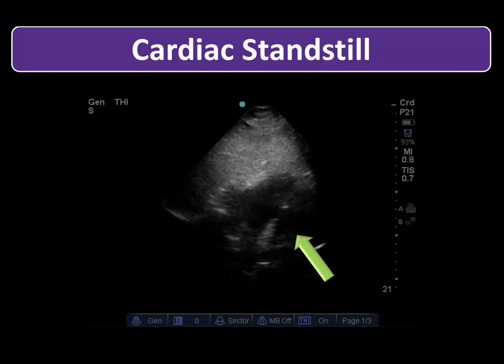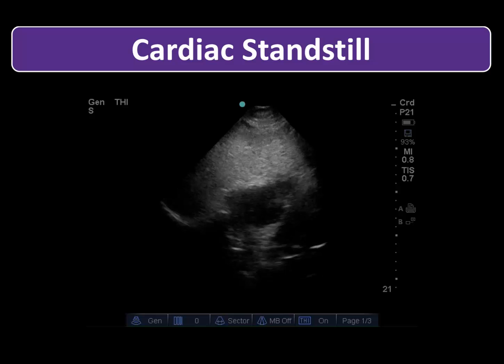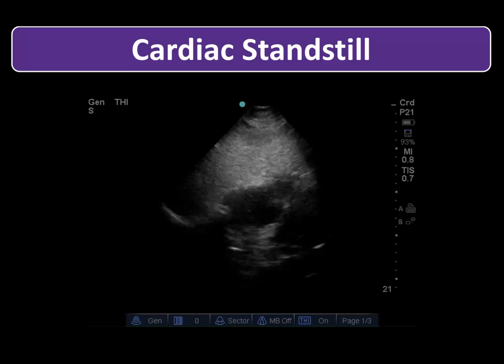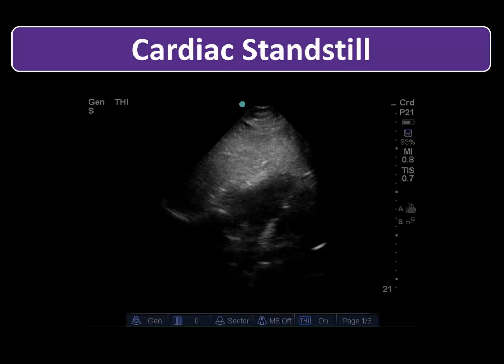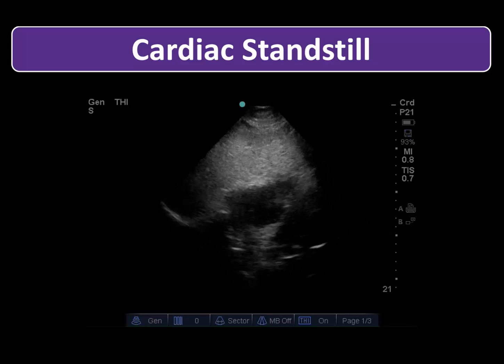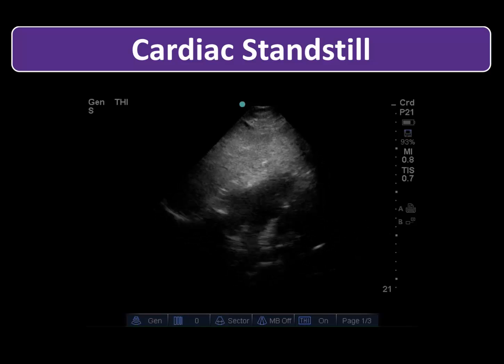Here you can see the heart, which clearly has no movement. This has prognostic significance as the image in the cardiac arrest scenario indicates a dismal prognosis. Remember, the objective of our exam is essentially binary, beating or not beating. We are not interested in gradations of LV function or regional wall motion. These evaluations require more advanced training and will be covered in future modules.